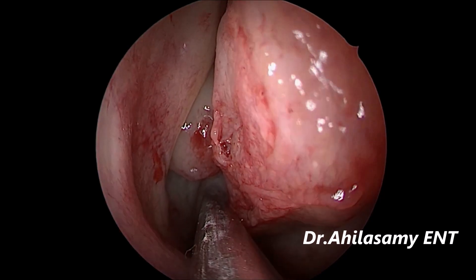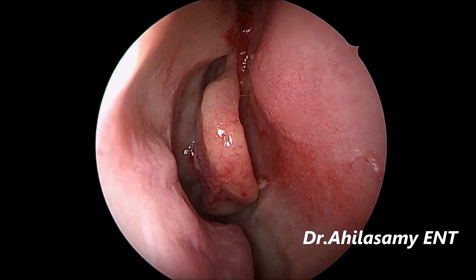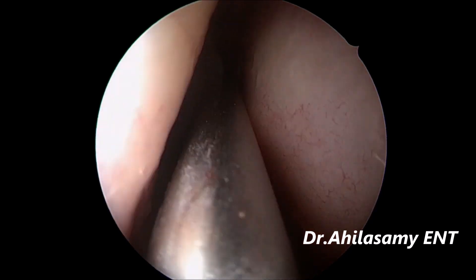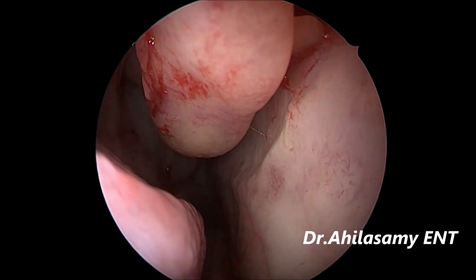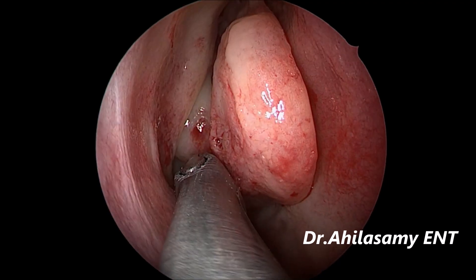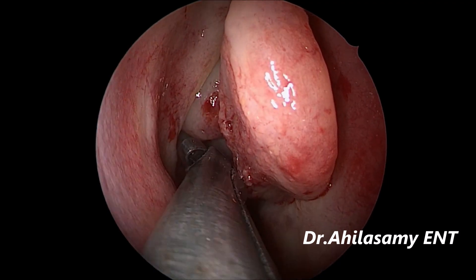When you do this procedure, you don't destabilize the middle turbinate as in a conchoplasty, or create a lot of raw area causing synechiae with the lateral wall. Now with the Nagashima backbiting forceps, you take three bites — one, two, three — to enter into the antrum.